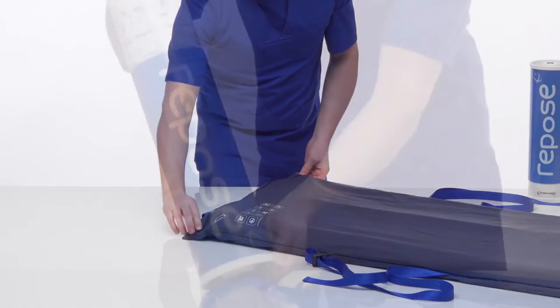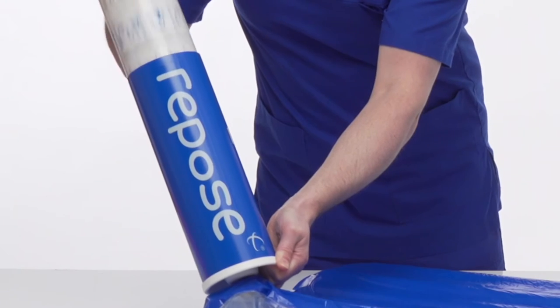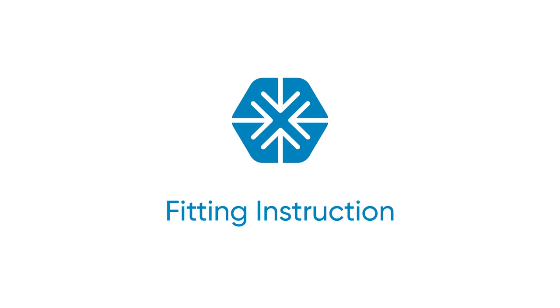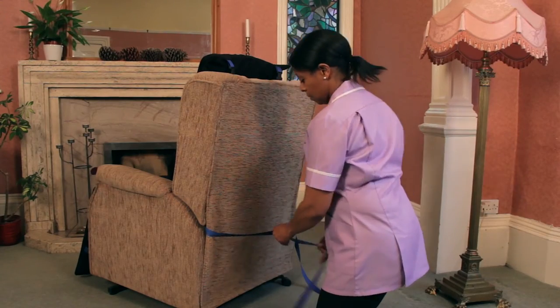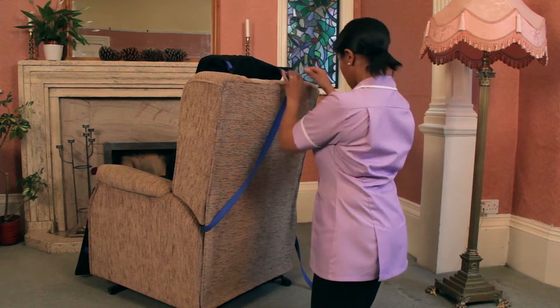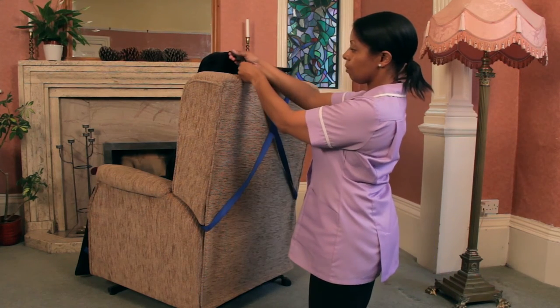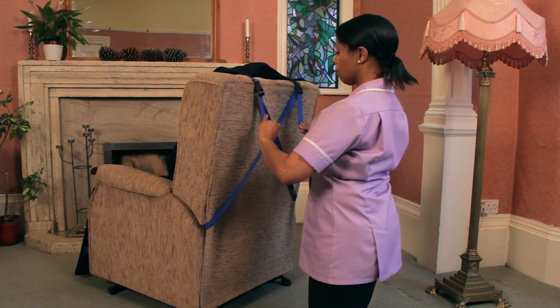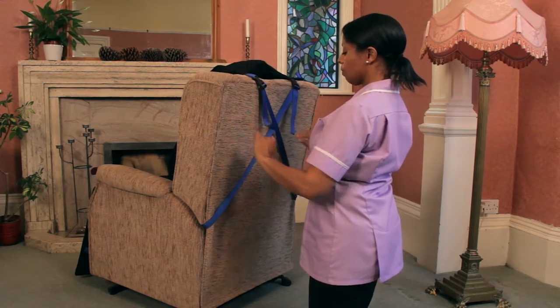Check Repose regularly and top up within a period of no longer than 14 days using the pump supplied. Install Repose with the valve facing down and away from the patient. Secure in place with the integrated retaining straps. Insert the fixing straps between the seat and the armrest, looping around the back of the chair, cross them and clip in place at the top. Loop the bottom straps around either side of the footrest.